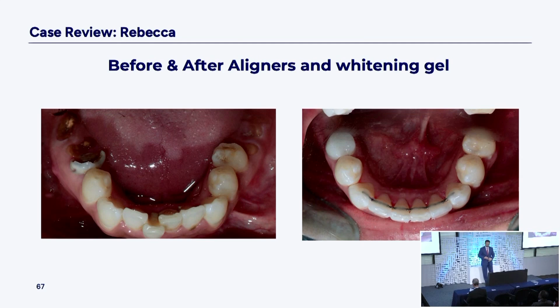In talking to the patient, she was concerned that she might slip and not wear her retainers very well. So we should probably put a permanent retainer behind your teeth, because those can relapse and I don't want to lose them at a quick pace. I'm going to put the lingual bar. It's reversible. It just gets bonded with a drop of flowable composite. You can polish it off and polish the enamel and have exactly the teeth back. So I'm not worried about removing it at a later date. If she ever tells me, look, I'm going to wear my clear retainer every night forever now, great, I can take that off for you.